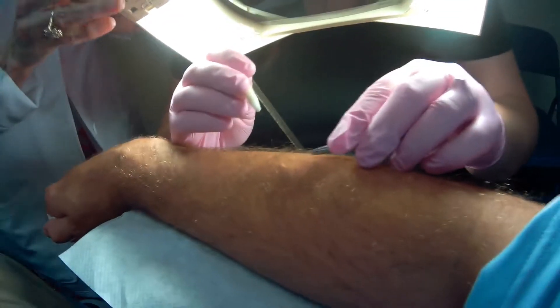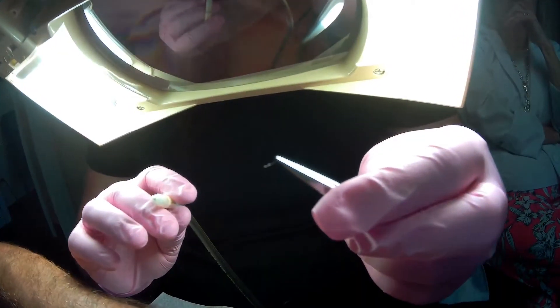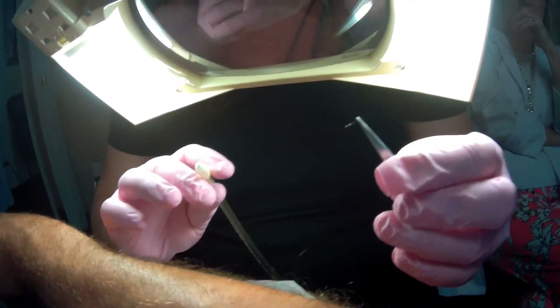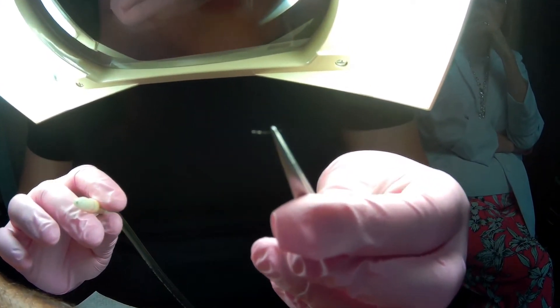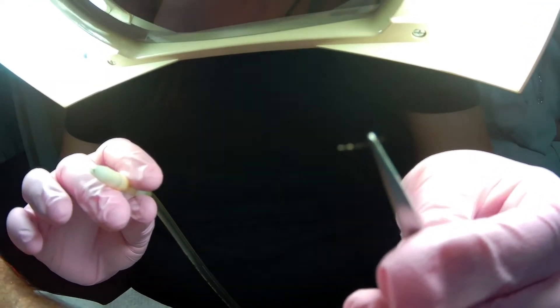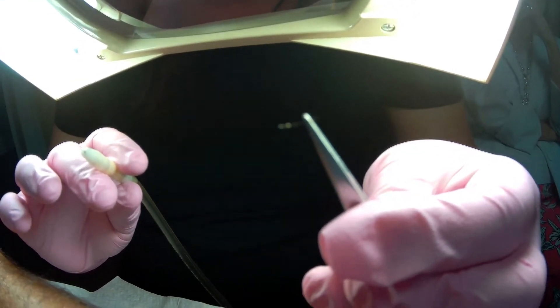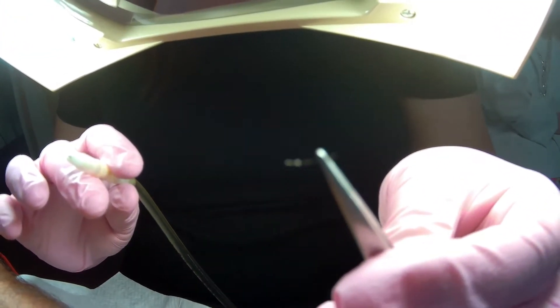Glad we can provide you this lesson here today, guys. We've got a bulb on it — does it have a black bulb on it, black coming in? A little bit, yeah. So that is a hair that's been successfully epilated. When you successfully epilate a hair like that, it has a big juicy bulb on it, so you know it was in the anagen phase.